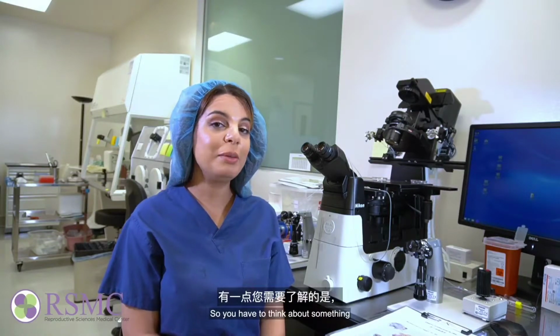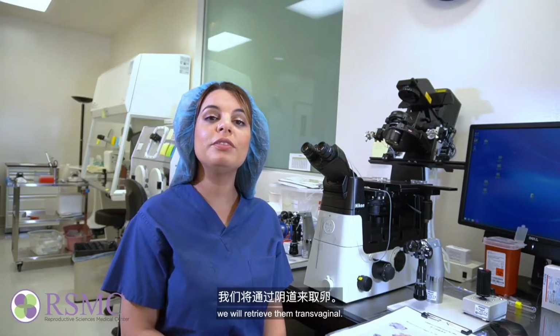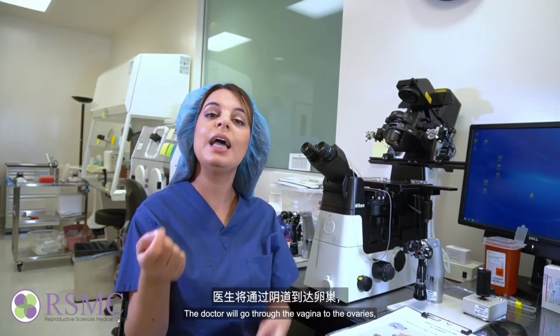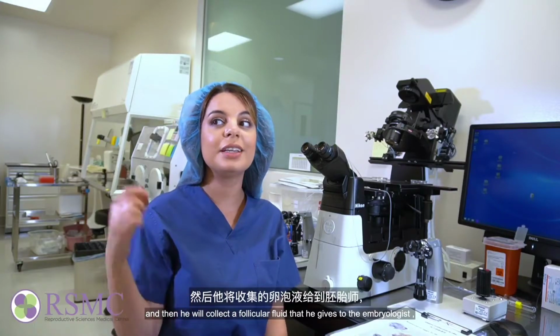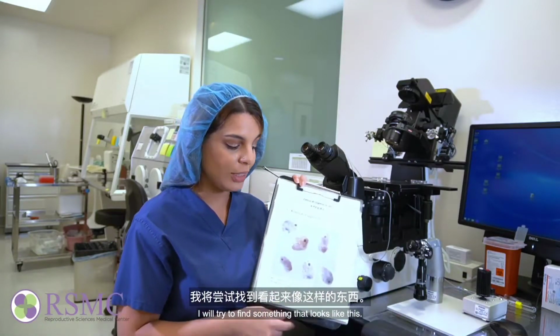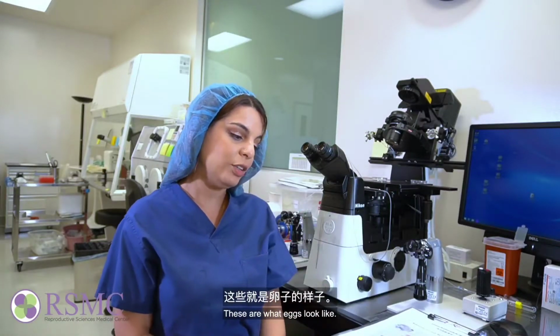So you have to think about something. When we are retrieving eggs from the patients, we will retrieve them transvaginally. The doctor will go through the vagina to the ovaries, and then he will collect a follicular fluid that he gives the embryologist, which is me. Then I will go look through the dish, and I will try to find something that looks like this. These are what eggs look like.